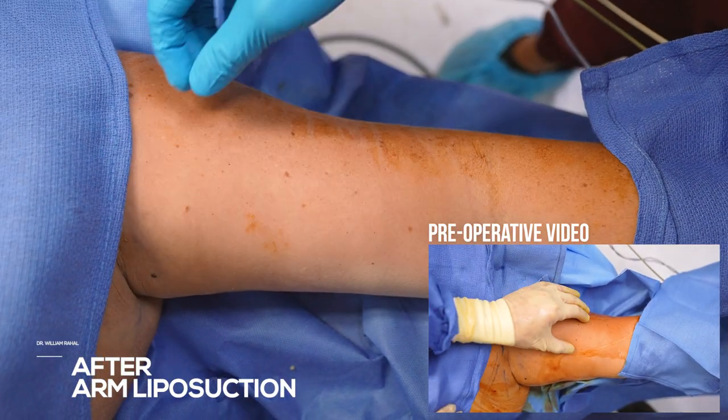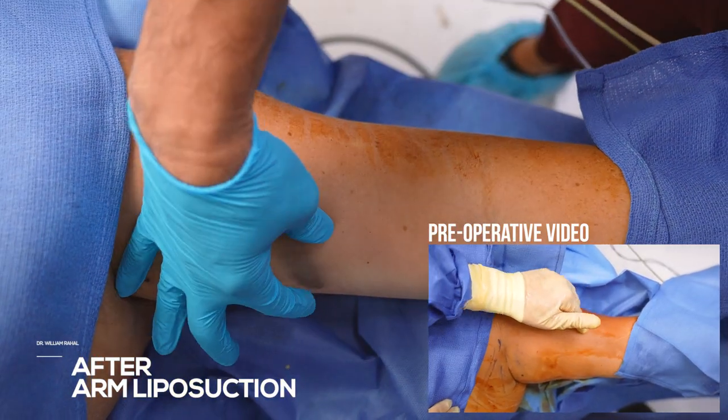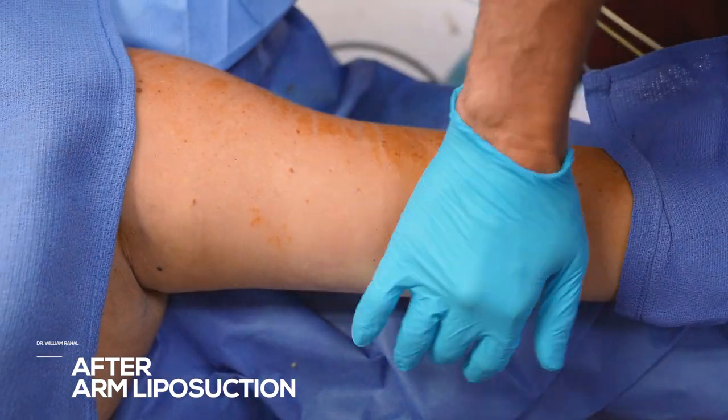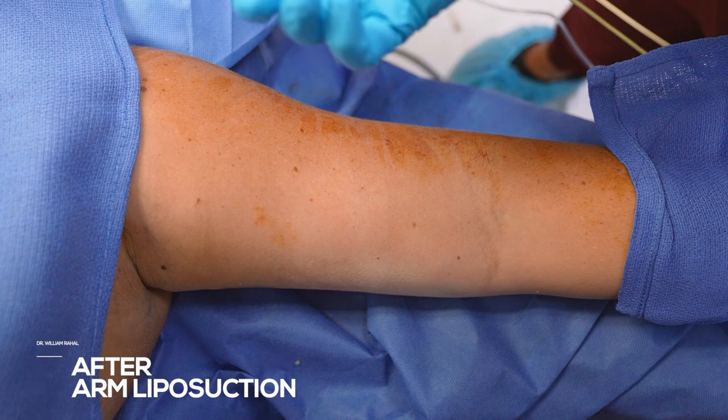I lipoed everything up to the bicep. Super thin pinch — really slimmed it out, and we also tightened the skin to improve that retraction.